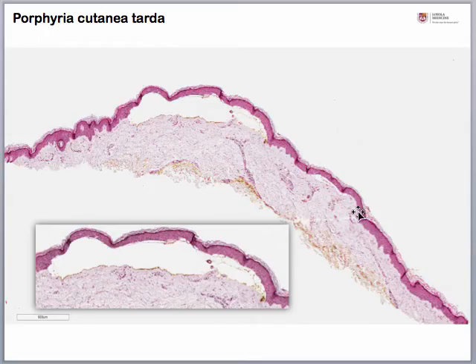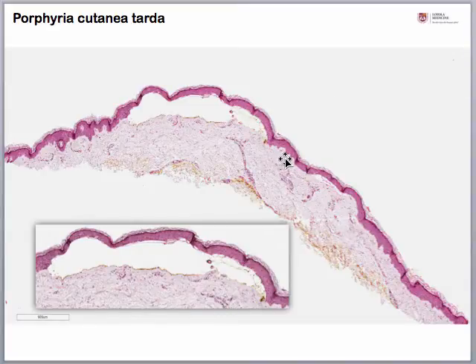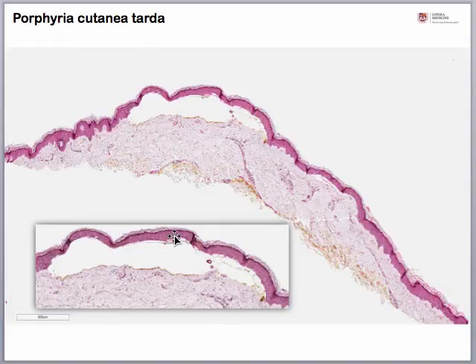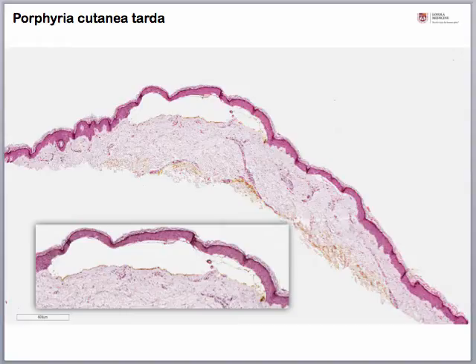The next case shows a subepidermal split between the dermis and the epidermis that is really lacking inflammatory cells — it's very clean. On higher power view, we can see caterpillar bodies, which are basically remnants of dead keratinocytes sticking to the roof of the blister, and hyalinized dermal blood vessels on high power. I strongly encourage you to go to the online review as well, where you will have access to annotated slides after the exam to review these features at much higher power.